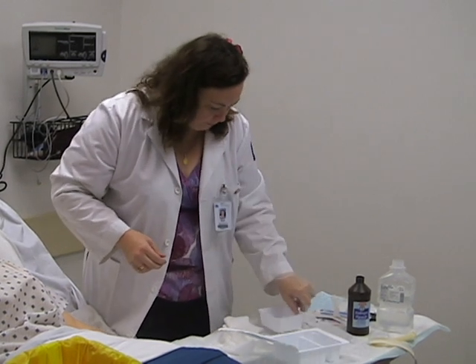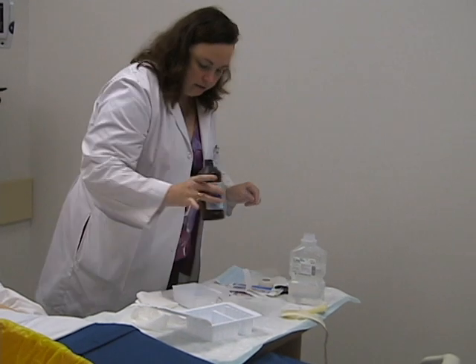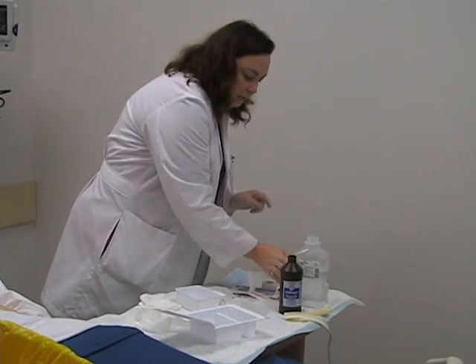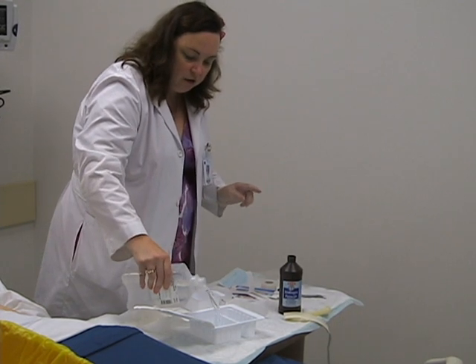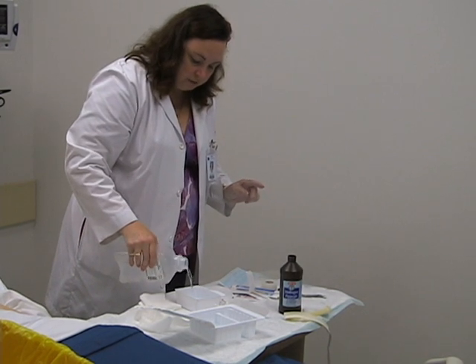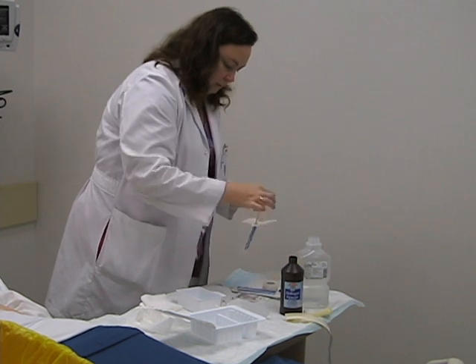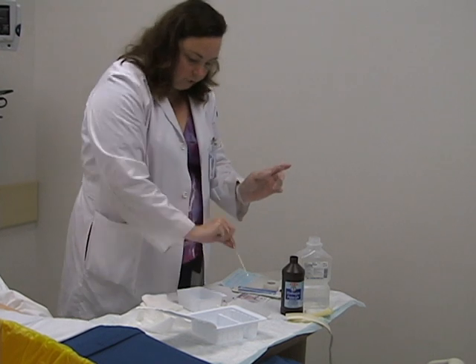I'm going to lift up my basin. Using my clean hand, I'm going to pour some of the solution — I've got peroxide here. Usually if you're going to use a peroxide solution, it's half and half: half peroxide, half saline. The other basin is going to be just plain saline for soaking purposes. Then I'm going to pick out my extra Q-tips.